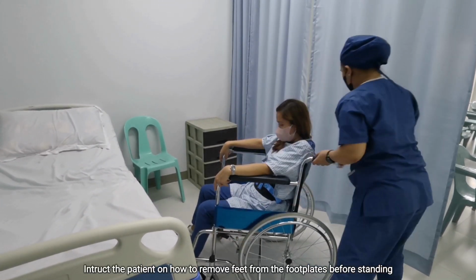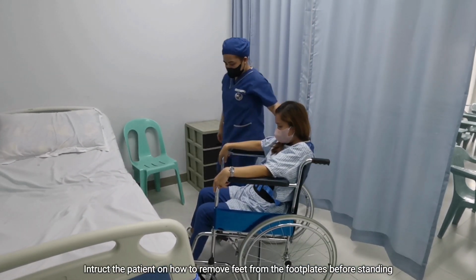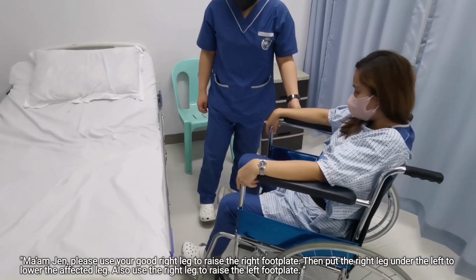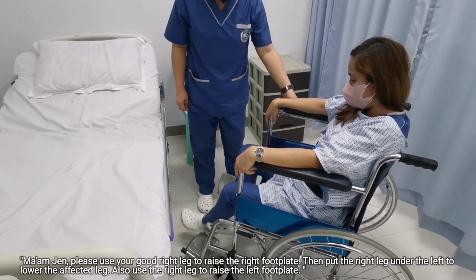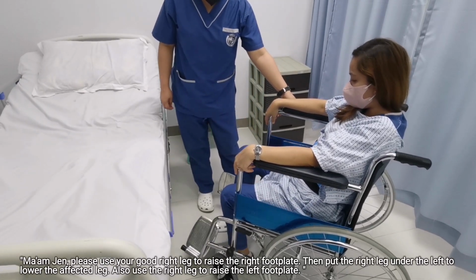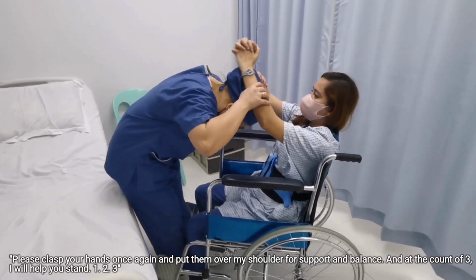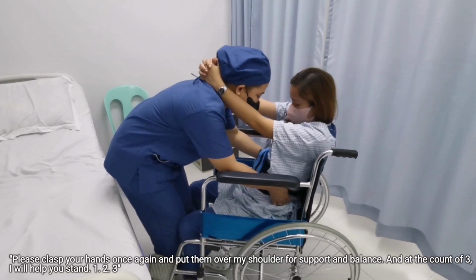Instruct the patient on how to remove feet from the foot plates before standing. Jen, please use your good right leg to raise the right foot plate. Then put the right leg under the left to lower the affected leg. Also use the right leg to raise the left foot plate. Please clasp your hands once again and put them over my shoulder for support and balance. And at the count of 3, I will help you stand.